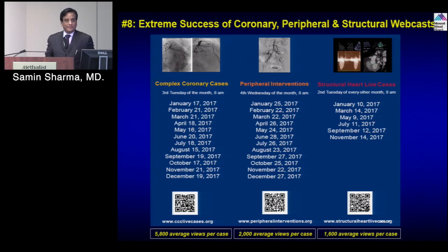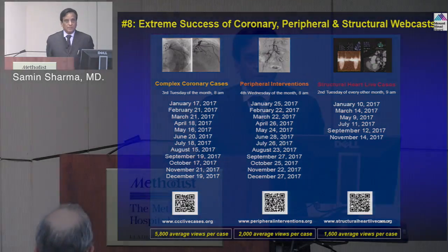My only question is, the perforation I see in our lab happens with a non-compliant balloon or using an AngioSculpt or cutting balloon, not with atherectomy. So if you're using a non-compliant balloon in a severely calcific lesion, you may open some of the lesions, but that's where your perforation occurs.